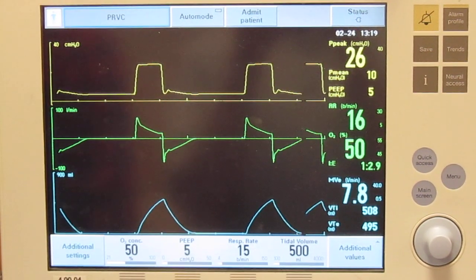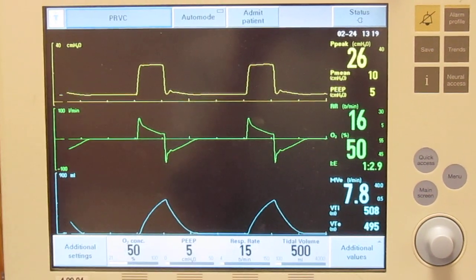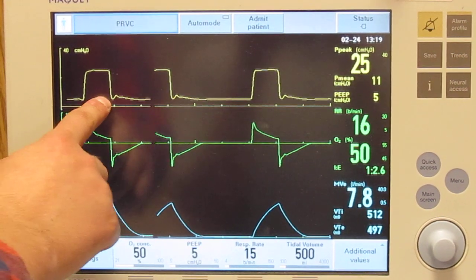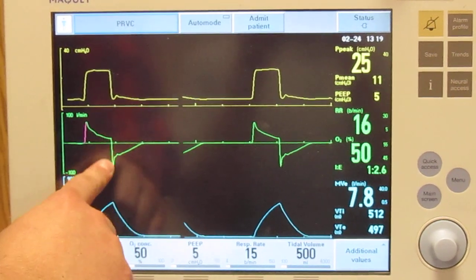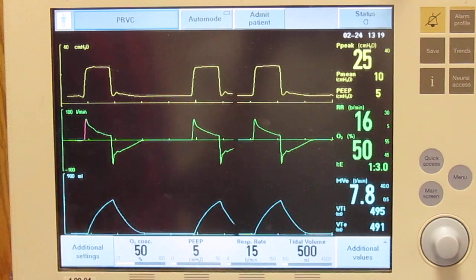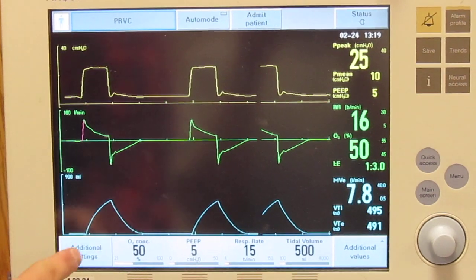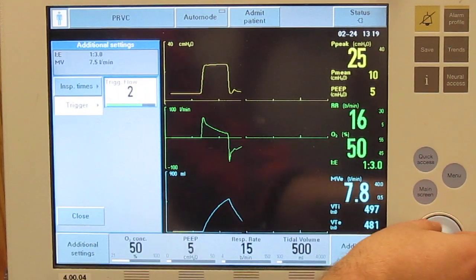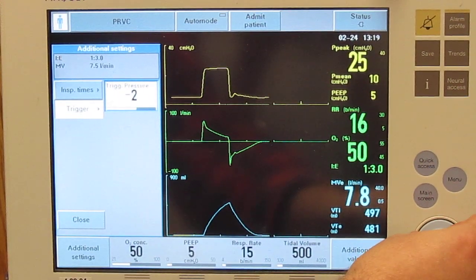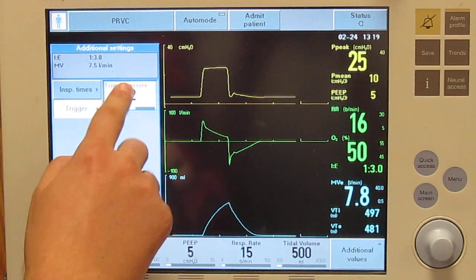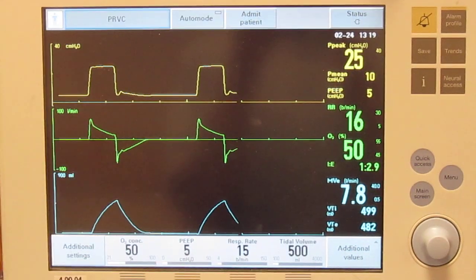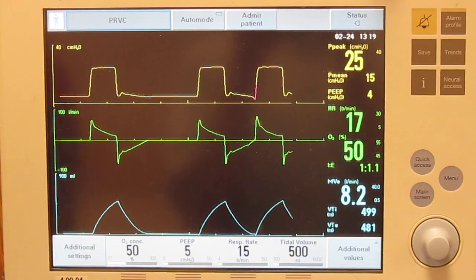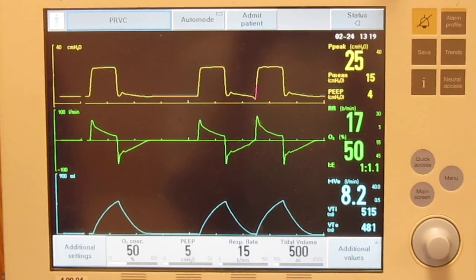We'll try it again. He's got mild and moderate retractions. It's time-cycled, not flow-cycled. It should be the same with pressure sensitivity. So there's the breath — time-cycled as well.